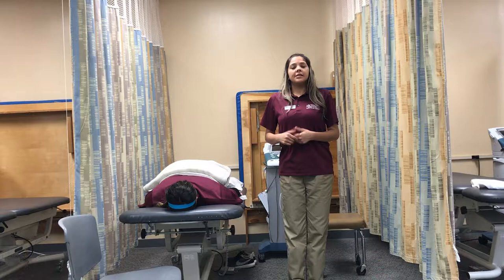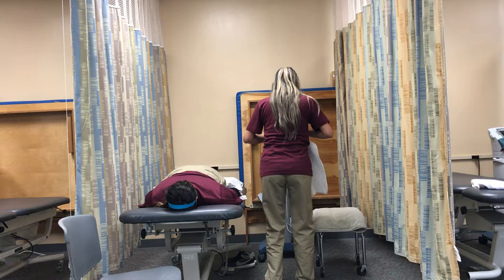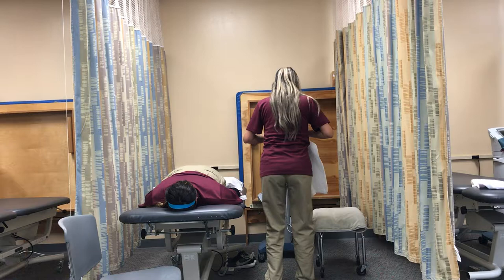The skin looks good. After 10 minutes, the treatment is done. I will reassess the skin again and remove the hot pack. The skin looks good. Do you feel my touch, Monica? Yes.